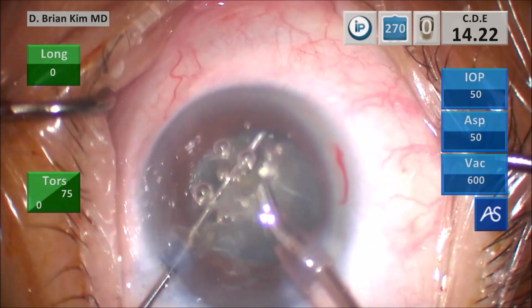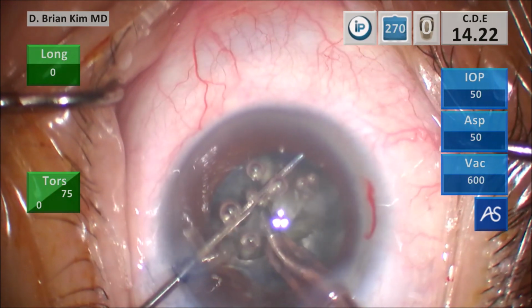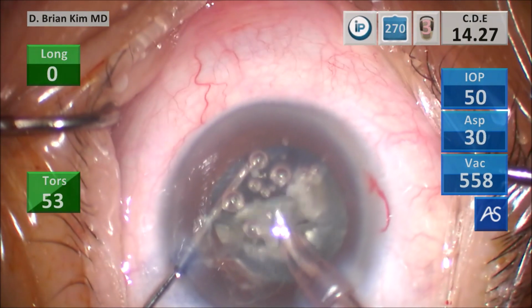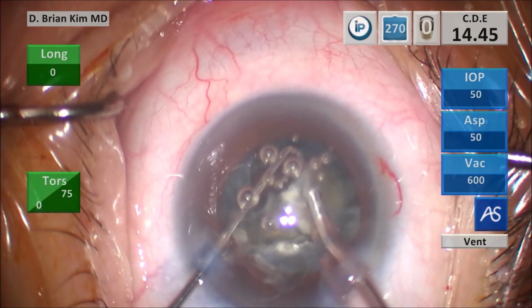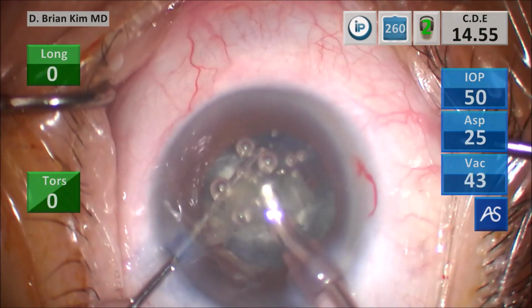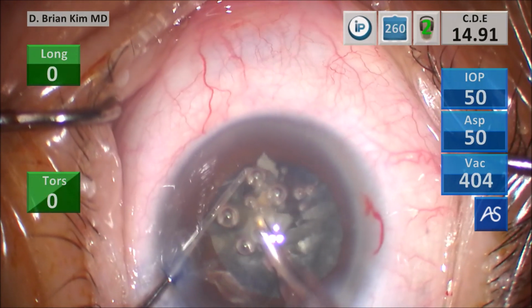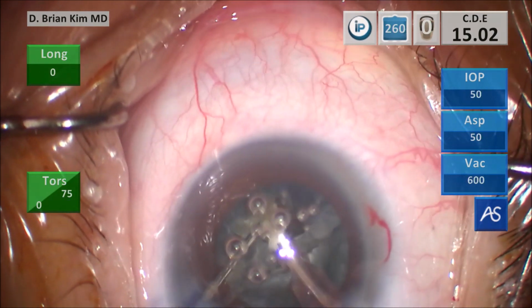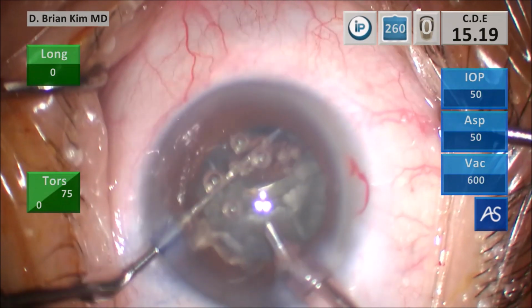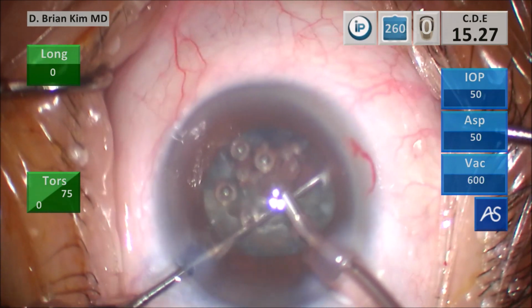And again, I'm performing cross-chop maneuvers, fracturing the lens pieces into smaller pieces, and then crushing the lens pieces with mechanical fracturing forces, crushing the pieces into smaller and smaller pieces, again, without the use of ultrasonic energy or vacuum, just breaking the lens pieces under infusion pressure. And then when I'm ready, I'm able to pulse with the ultrasonic energy and vacuum, and then remove the lens pieces. Gently turning that second heminucleus in front of me.